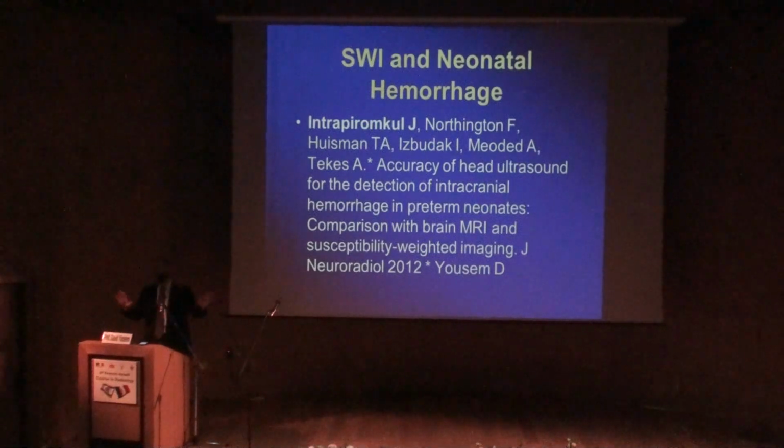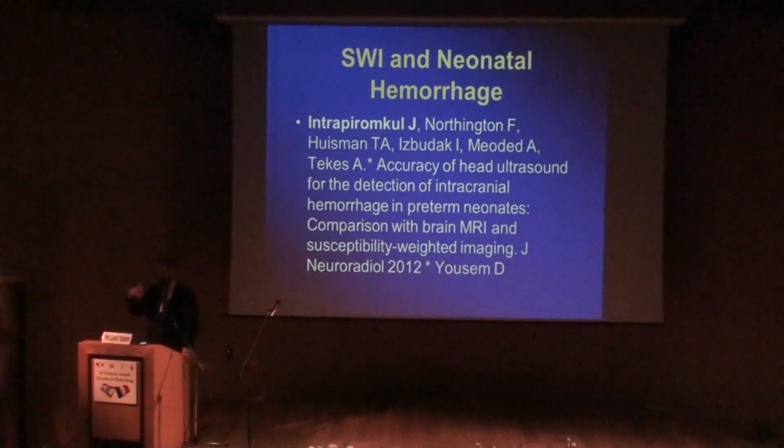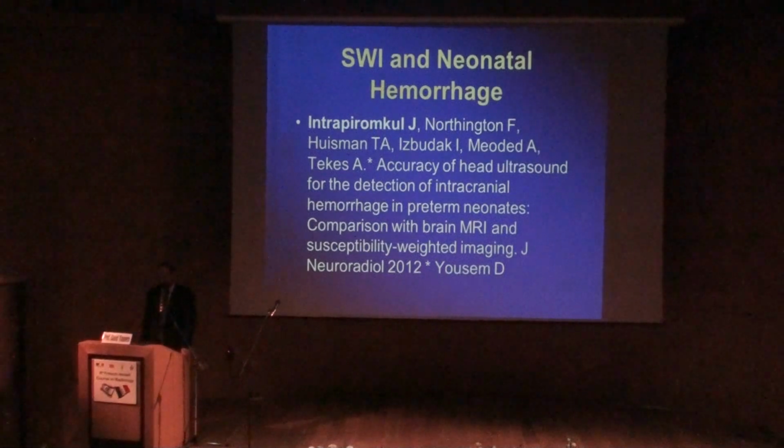Now, in most instances, you're not going to be doing an MRI in these patients. This is really a diagnosis that is made by ultrasound. But we wanted to know whether the performance of the MRI would add anything to the ultrasound that would change management. And we do have a proliferation of MRI machines at Johns Hopkins. I was describing that we have about 18 MRI machines in the Hopkins system, so we have ready access to MRI.